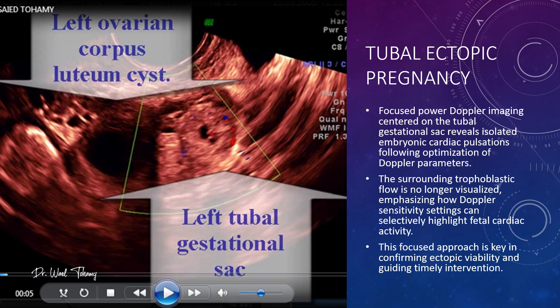Here is a focused power Doppler view of the tubal gestational sac. Watch closely — after optimizing the Doppler settings, we can now pick up isolated embryonic cardiac pulsations. Notice how the surrounding trophoblastic flow disappears. That's the effect of adjusting Doppler sensitivity to selectively highlight fetal cardiac activity. This focused approach is crucial for confirming ectopic viability and making timely management decisions.